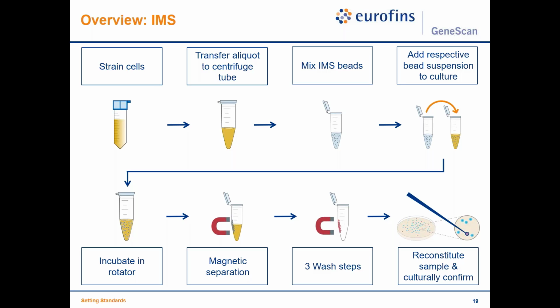So here you can see that you could go on the plates as is described by the MLG, but as I said before, you can also then take these washed beads and go into PCR and basically confirm your results from the initial screening PCR on your beads, which is a further indication of the presence of an STEC.